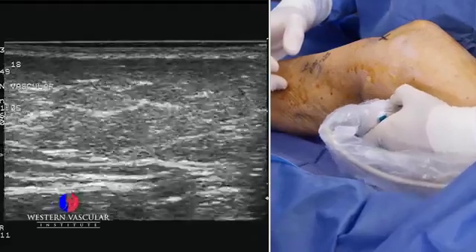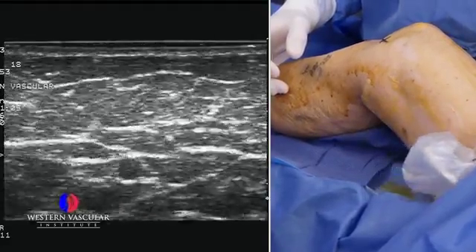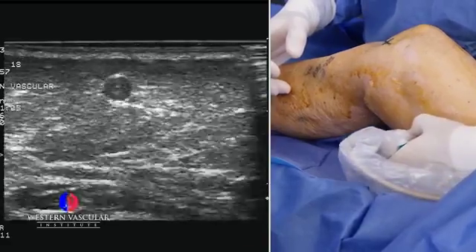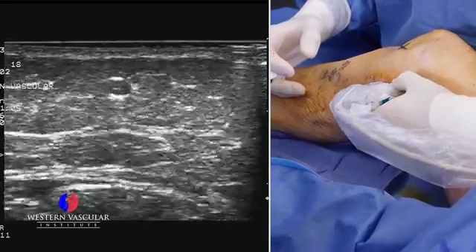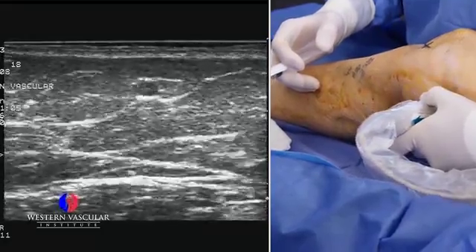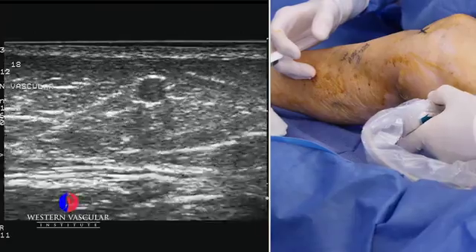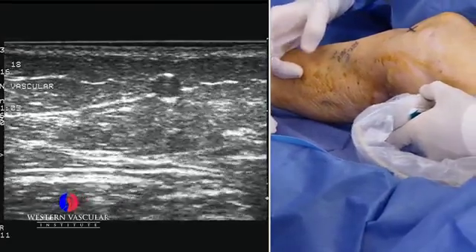Not all the valves are incompetent. Our ultrasound technicians look at each set of valves and determine which ones are incompetent. At some point there will be competent valves — I would guess this vein down towards the calf has a competent system. So we want to target the incompetent vein, which is dilated with incompetent valves, and that looks like a good area to start entry into the vein for the ablation procedure.